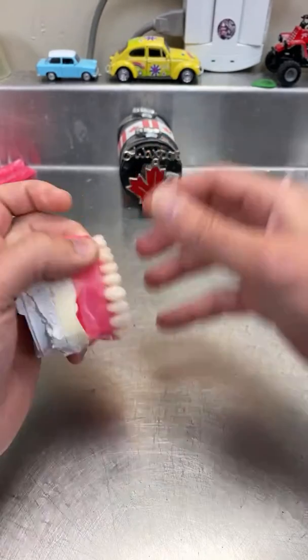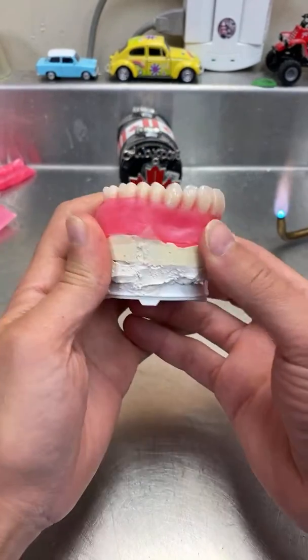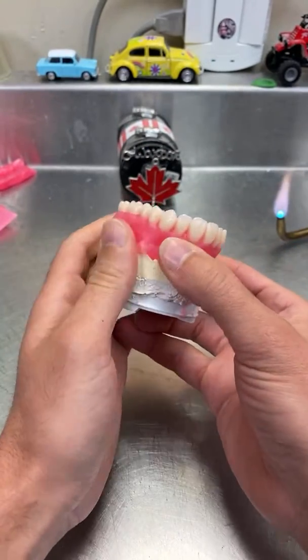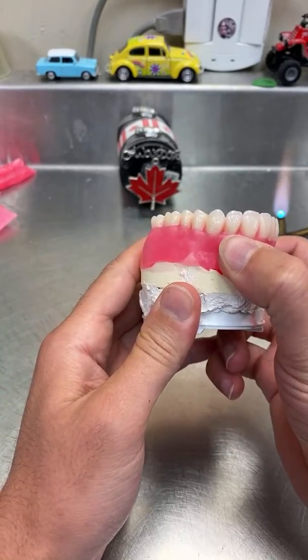That's my favorite way of doing the waxing, and the fastest too. But it's very tricky because you don't want to press on the teeth. You have to press here and up.